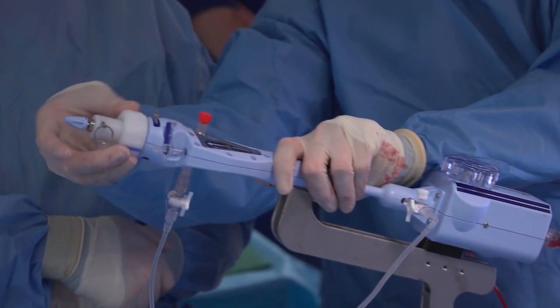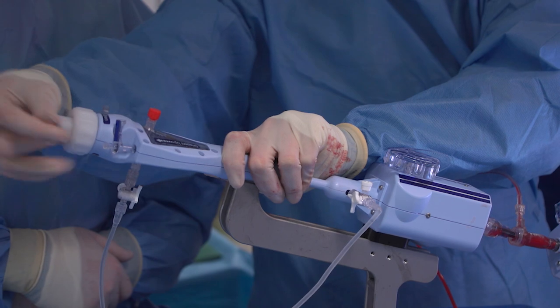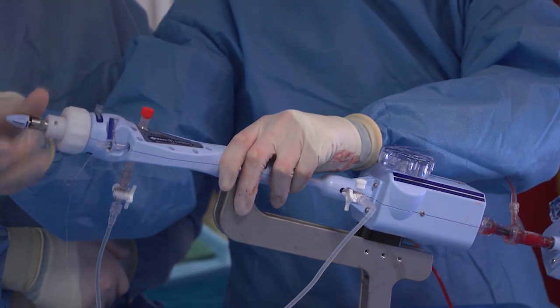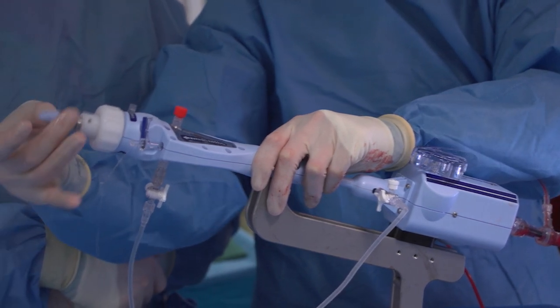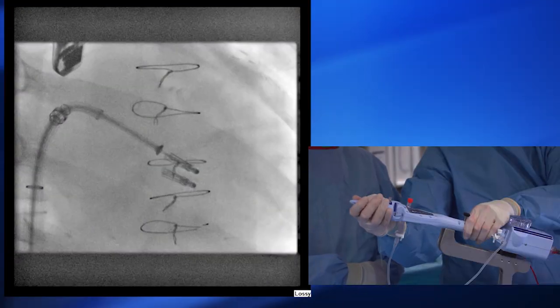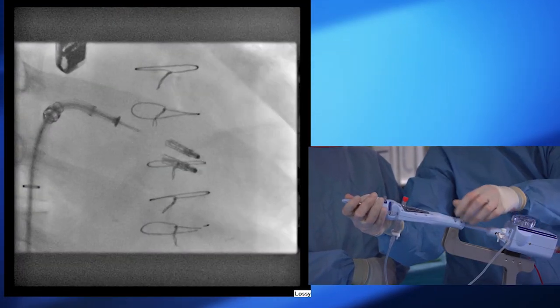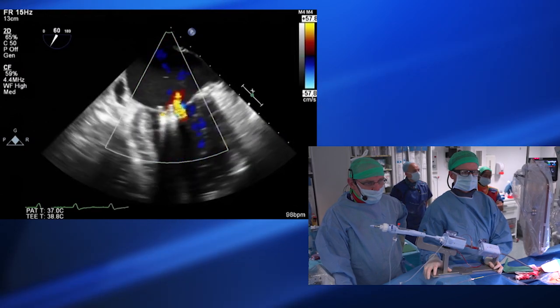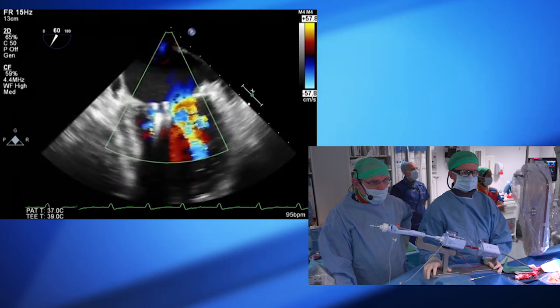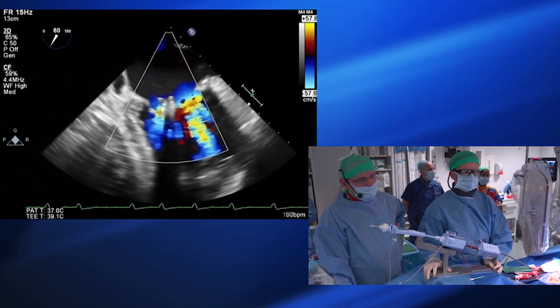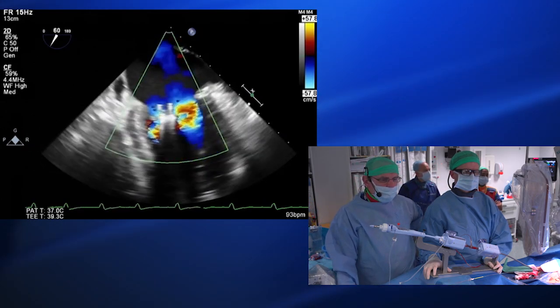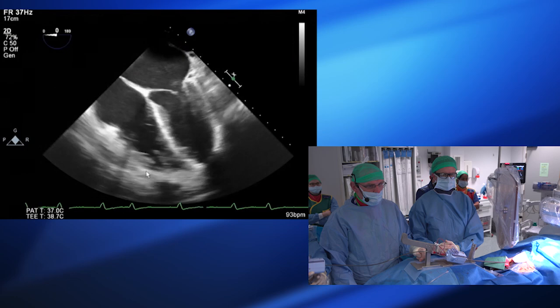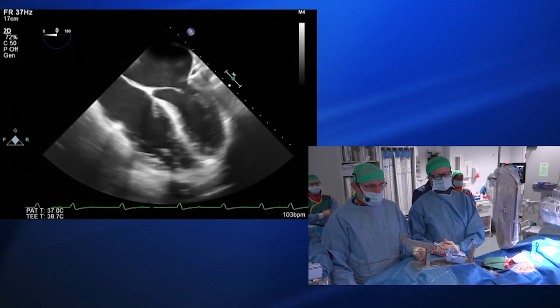Testing the lock one more time — which looks good. Let's release this clip. As you can see, very nice and stable. Looking at the bicommissural view — both clips are lovely and parallel and nicely stable. We have just that very small residual spray of MR just alongside the lateral border of the second clip — nothing new or different. That's a percutaneous mitral repair for this man with torrential mitral regurgitation who is at very high risk for redo surgery. We've seen a reduction in the MR from torrential to probably mild.